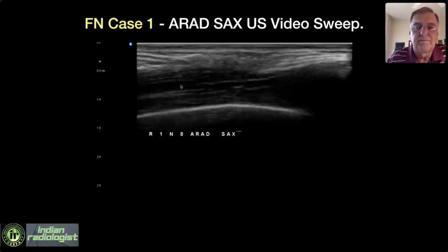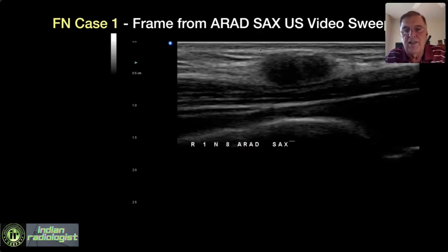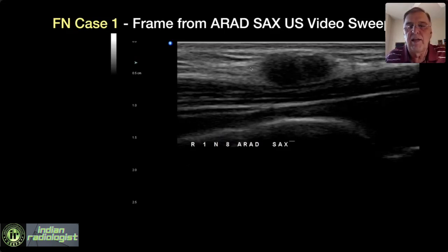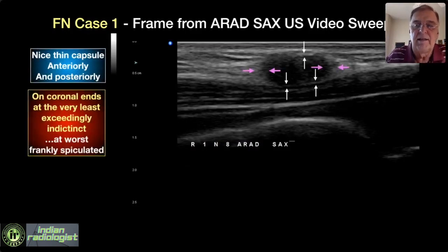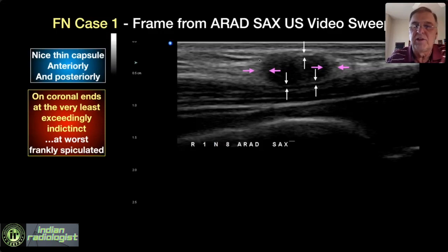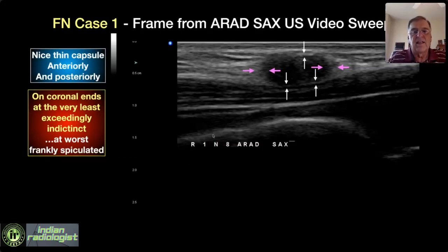Here is a still image from the short axis video sweep (SAX) — scanning across the lesion in the short axis of the transducer, starting outside in the surrounding tissues on one side and going all the way through to the outside tissues on the other side. Notice that it has a thin capsule on the front and back, but it does not have a thin capsule on the ends. If you're going to call something a thin capsule, it should be completely surrounded. The path of low resistance for invasion is between the tissue planes — in the coronal plane — on the sides of the lesion. Many of these false negatives were quite scary looking on the sides, but falsely reassuring on the front and back.